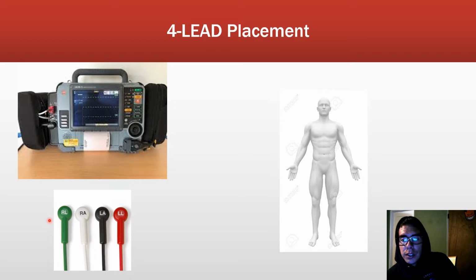So these 4 wires or electrodes are referred to as limb leads. So if someone says something about limb leads, it's going to be one of these, the right or left arm or right or left leg ones. So 12 lead ones that you actually put along the chest, those are called precordial leads, and we'll talk about those in the next slide, but these are called limb leads. And it's white on right, smoke over fire, and ground.